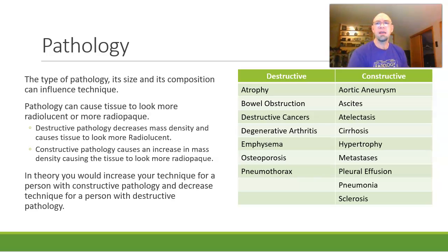Hey everyone, it's Joe, and I'm making an addendum video that I promised that I would regarding pathology and whether or not it adds to the radiolucency of your image, meaning it's a little bit darker gray, or the radiopaqueness of the image, meaning that it's lighter gray or white. And so pathology can affect the overall look of an image or parts of an image because of the pathology associated with the body part that you're x-raying.